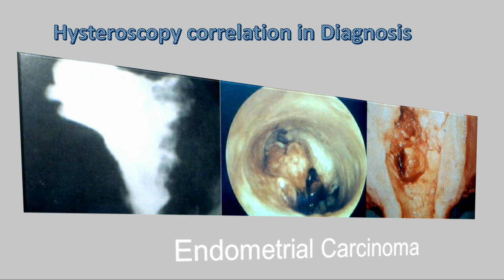This is endometrial carcinoma. We can see irregular linings are there. This is endometrial carcinoma.